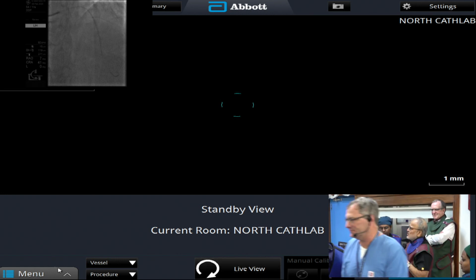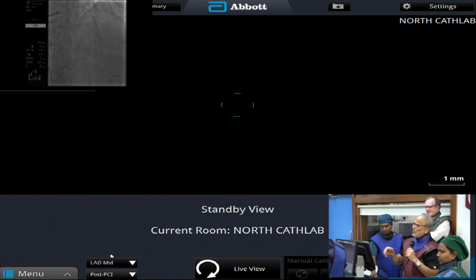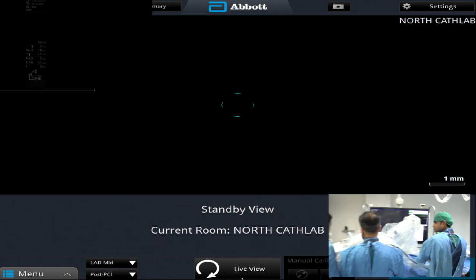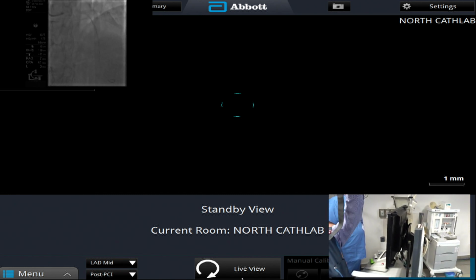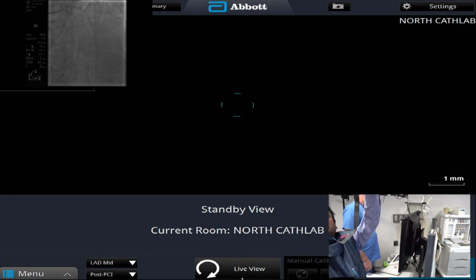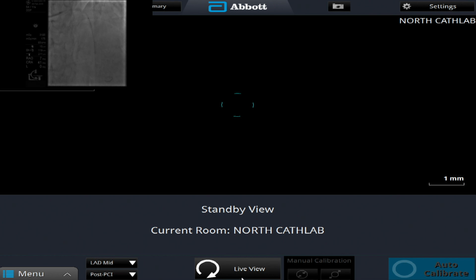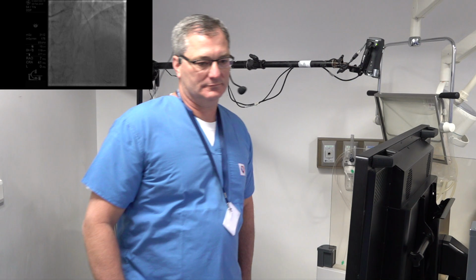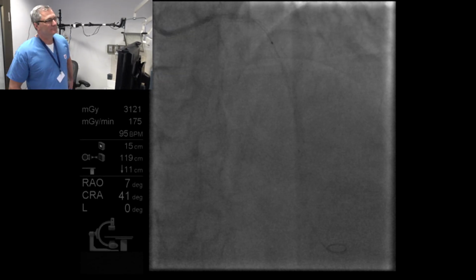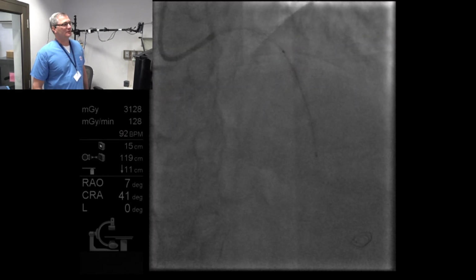This is a problem because they're not going to be able to hook it up. Just pull the stent back and the guide will go in. Yeah, just pull the OCT back a little bit. OCT, sorry. Pull OCT back. Test that. There we go. But you have to go a little distally. It's okay, I'm just going to kick your guide out. There you are. Go.